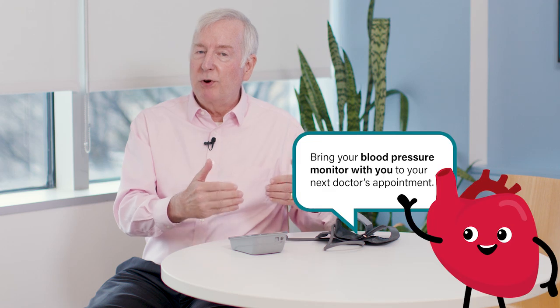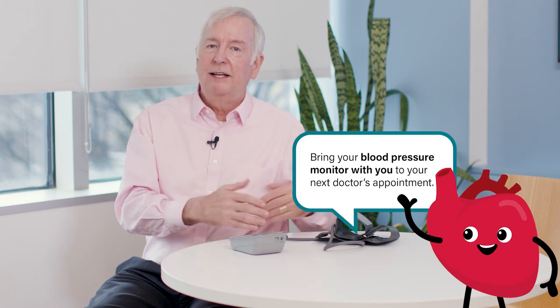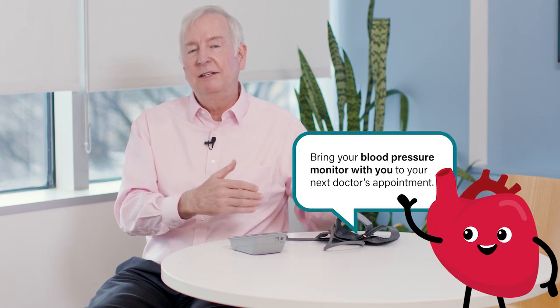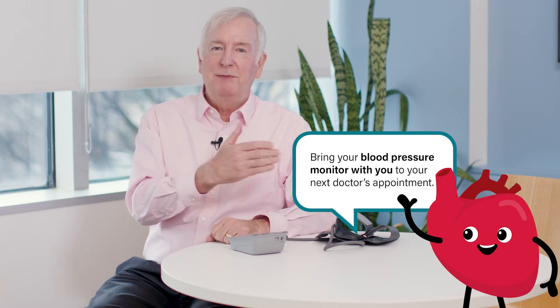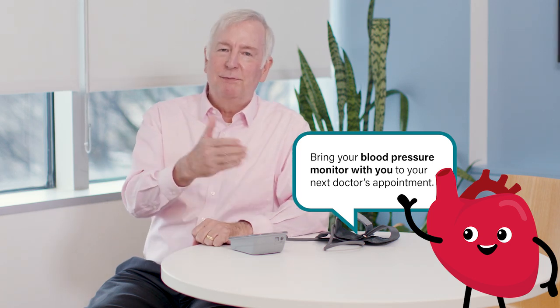When you're trying to make sure your device is working well for you, a good idea is to take it in when you see your doctor and have it compared with the blood pressures that you get in the office — to make sure what you get with your machine is similar to what your doctor gets when you're in the office, so you know you're getting good numbers. But it's also important to take your blood pressure using good methods.